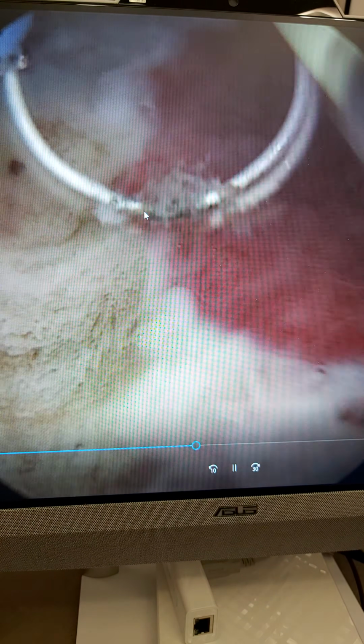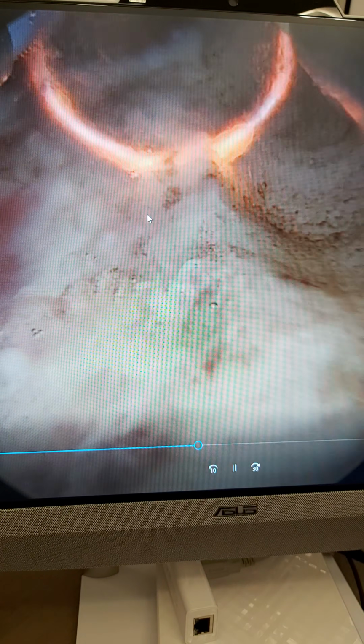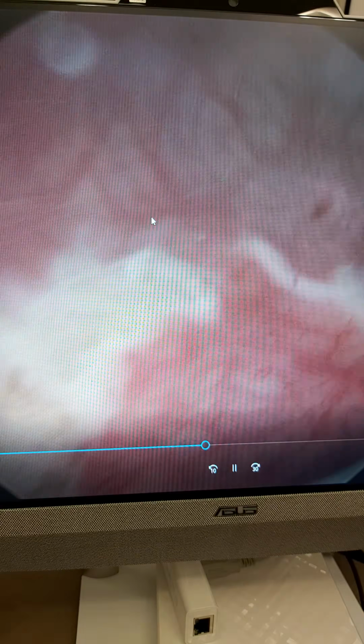So when I understand that it's not easy to fulgurate them, we make a resection. This is another feature of our device. This device is used for bladder cancer operations and prostate operations, so it has the capacity to resect, to cut the tissue more deeply.